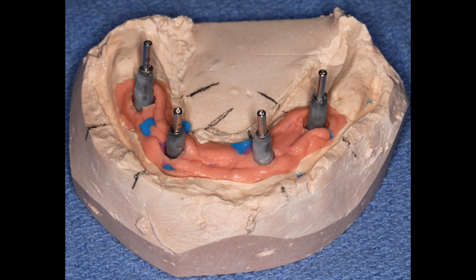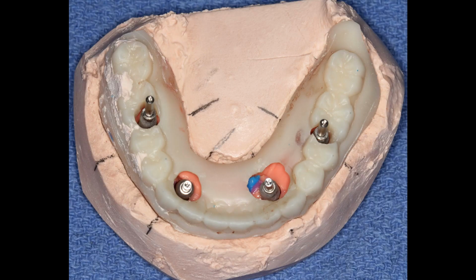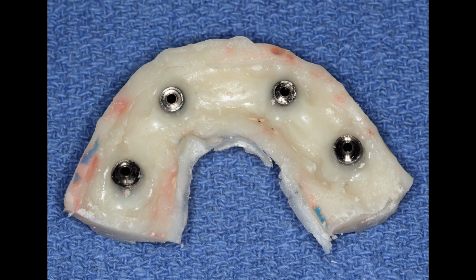The cylinders and the pins are what connect the temporary to the implants. Those are called provisional copings. By taking a shell prototype, we can start making openings for connecting the temporary to the provisional copings. This is an acrylic. It's called crown and bridge acrylic. It's what we make all our temporaries from. Now I've filled the holes in between the cylinders and the temporary, and we've got this large block of acrylic that now needs to be shaped to look like teeth.